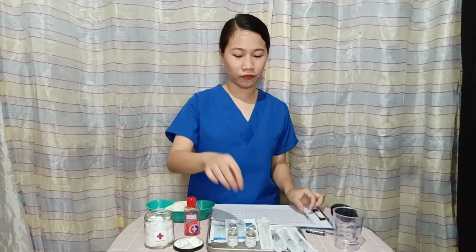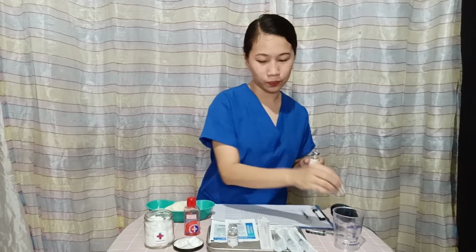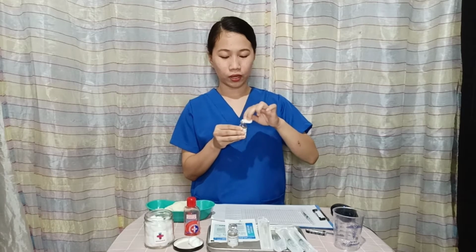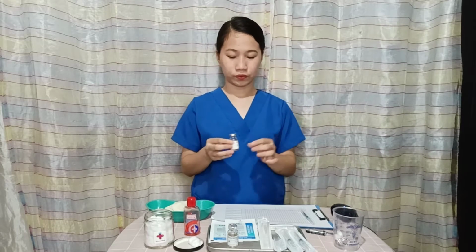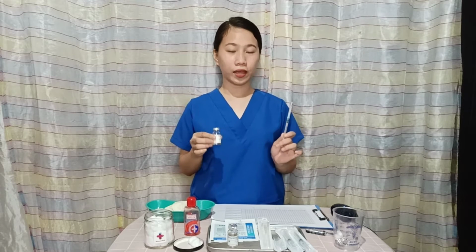Then next, open the vial. We need to remove the cap. Then, clean the top of the vial in a circular motion. Then, discard into a waste container. Next, get the syringe and uncap.